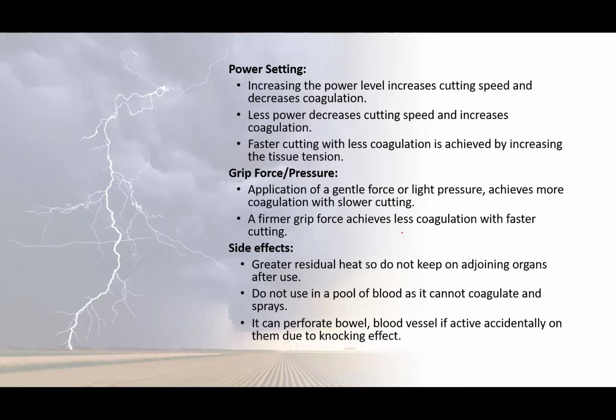Now, the grip pressure. How do you grip the forceps? Application of a gentle force or light pressure achieves more coagulation with slower cutting. So when you grasp the tissue gently, you apply more coagulation than cutting. A firmer grip force achieves less coagulation and faster cutting. So all this you need to know about the handle when you are manipulating a harmonic scalpel.